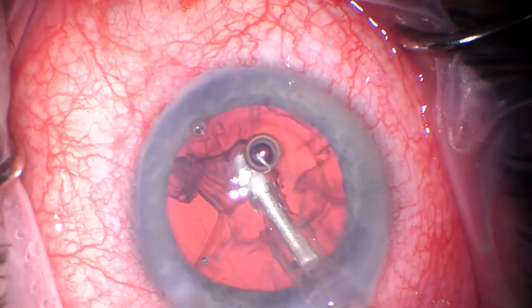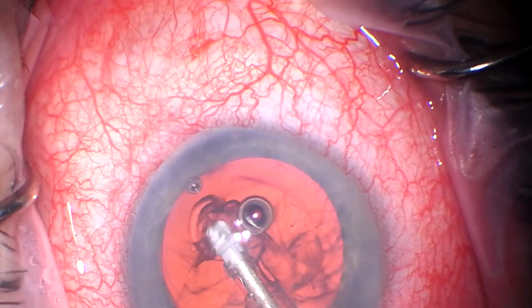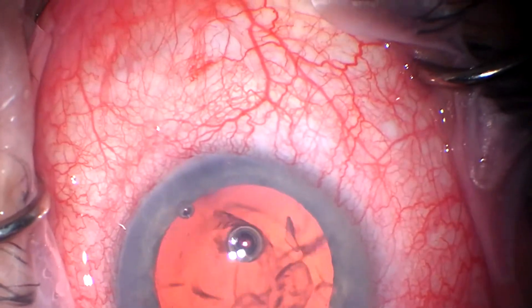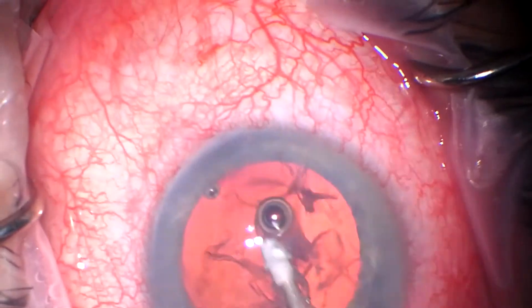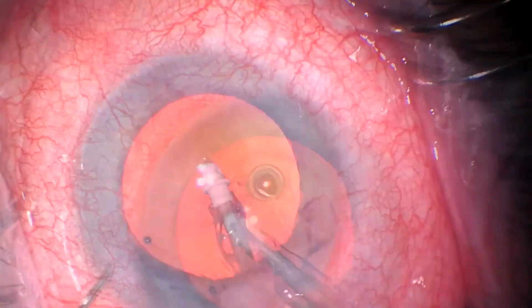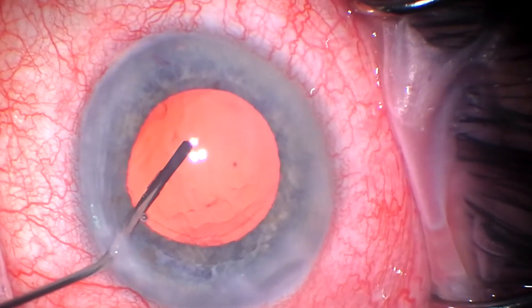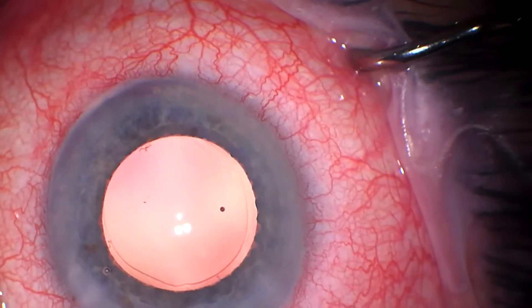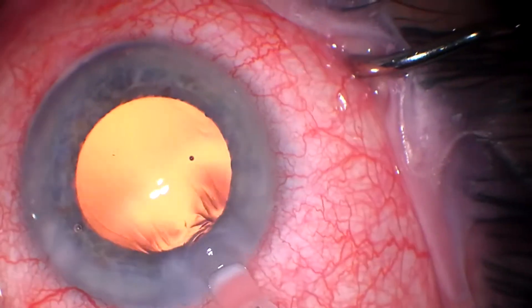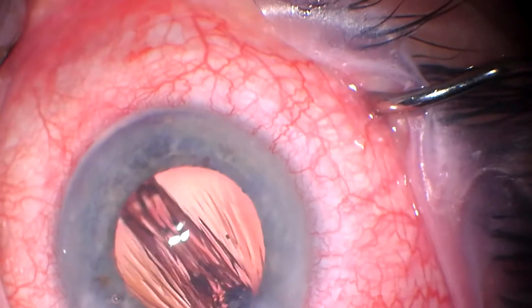Here we'll get the cortex out. And if you watch my other videos, you know I advocate for polishing the underside of the anterior lens capsule. I don't actually do it in cases where pupil dilation is not super great. Here you kind of can't even see the edge of the rhexis as well, and so if we polished, you would risk rubbing the underside of the iris.